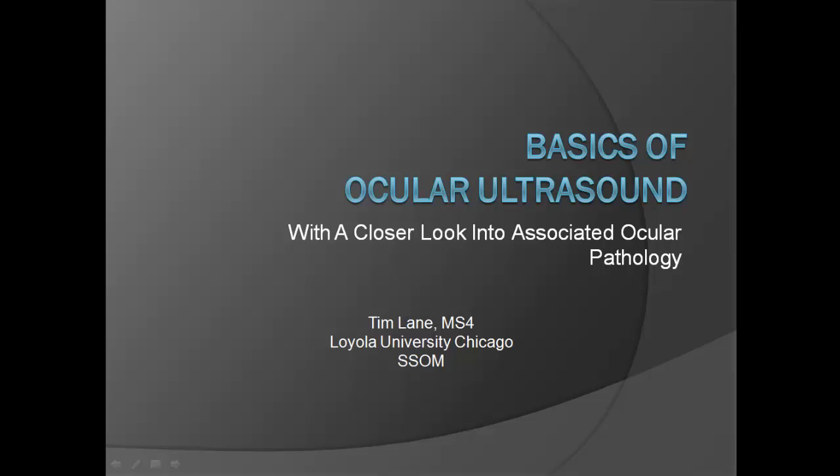And with today's podcast, I'm going to be talking about the basics of ocular ultrasound within the emergency department and take a closer peek into associated ocular pathology.